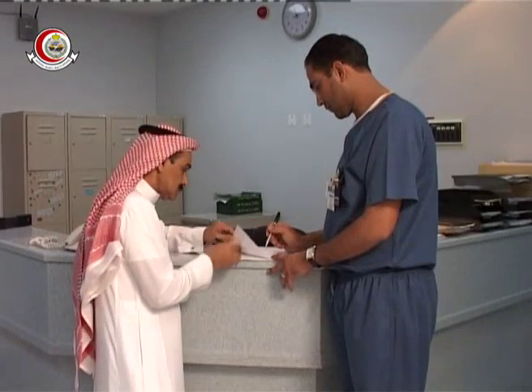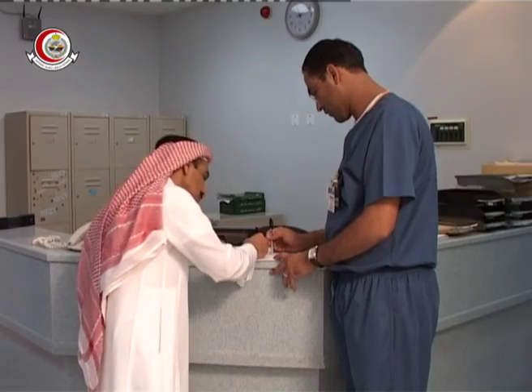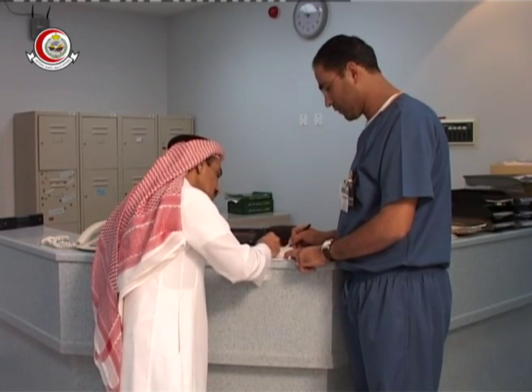The doctor explains the procedure to the patient's father before entering the angiosuite. The anesthesiologist then obtains the informed anesthesia consent from the patient's father.